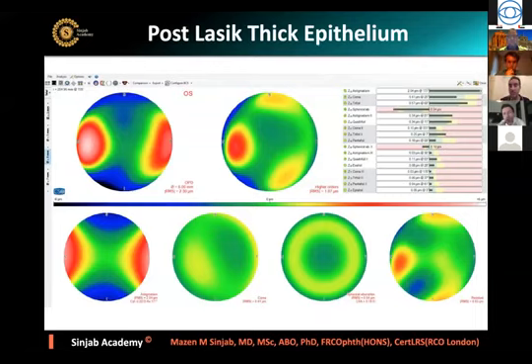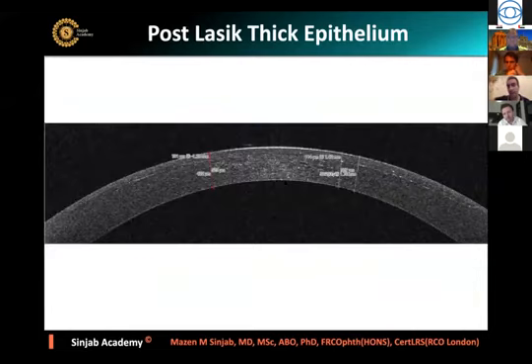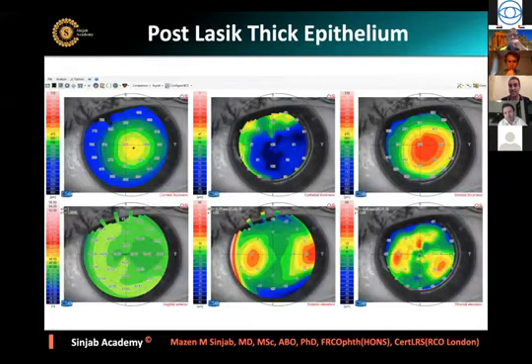But peripherally, it's going to be different, and it's the same thing Dan Reinstein showed with the Artemis: the peripheral will be more if you take the reference point as a point which is higher and almost parallel to it. It will be 65 versus still 50 here. So what I do is convert the peripheral epithelium, because here it's very tricky and I want to make sure. But as Juan mentioned, it's weird because it's going all the way. Centrally, you're pretty sure. Peripherally is actually what's different.